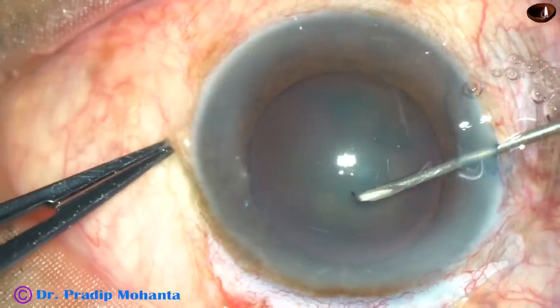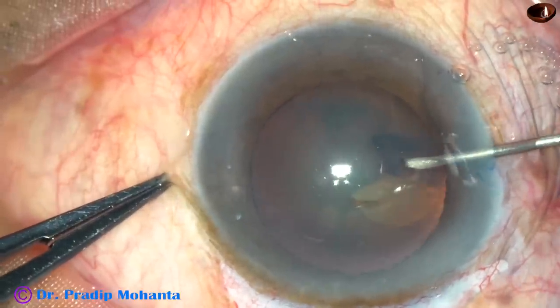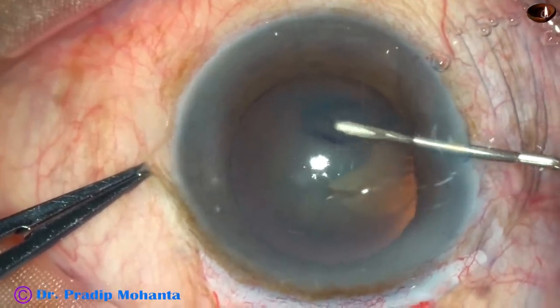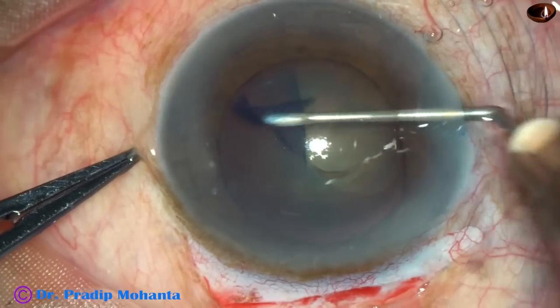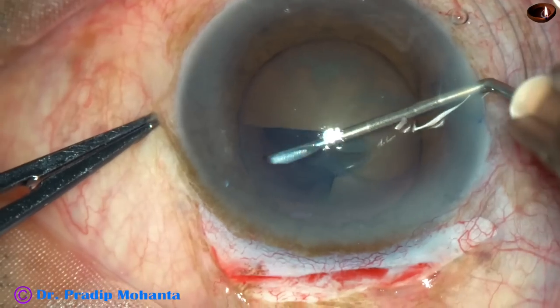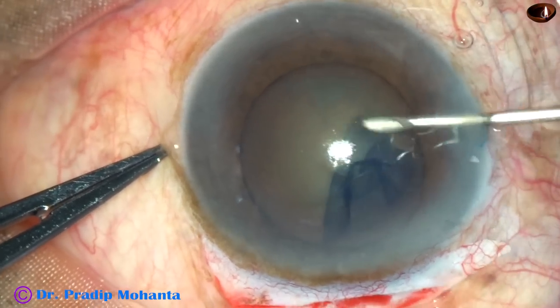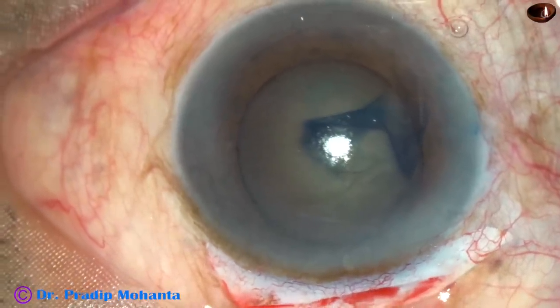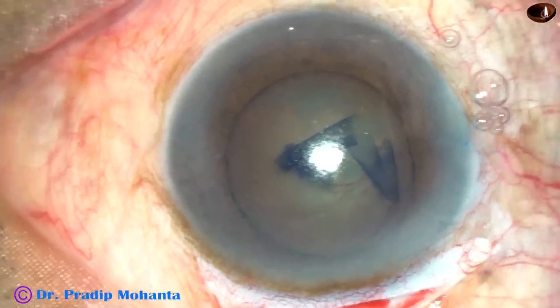Go in, incise the capsule, and make a flap. Flip this flap so that the undersurface is facing the corneal endothelium. Guide this flap and go along the border — in this case the pupil size is about 6 mm. If the pupil is fully dilated, you don't go along the border; stay away from the margin. Make a rhexis of about 6 mm so that nucleus prolapse becomes very easy. Now inject visco.